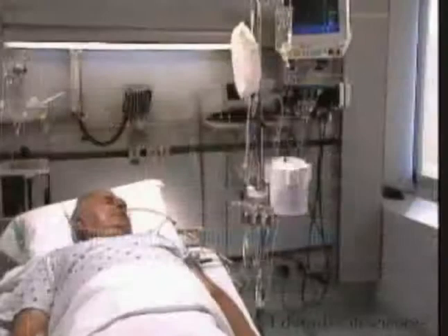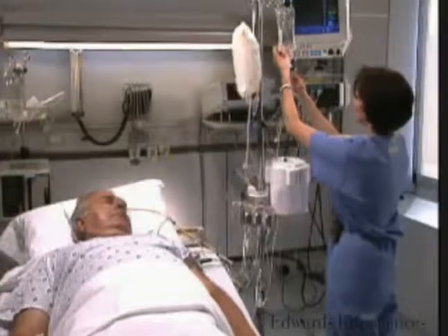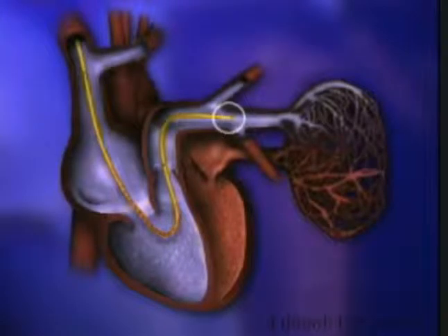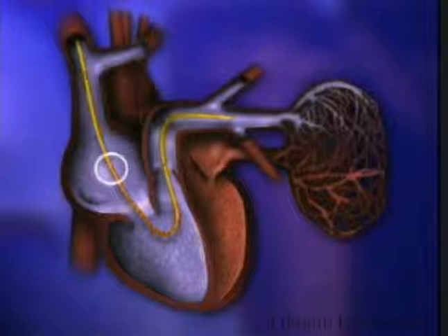The new technology of continuous cardiac output eliminates most of the errors just described with the bolus technique. Proper placement of the catheter is still essential, however. The catheter tip must be centrally placed in the pulmonary artery, using 1.25 to 1.5 cc's of balloon inflation volume for obtaining a proper wedge waveform. The injectate port must lie in the right atrium, and the distal end of the thermal filament must be in the right ventricle.